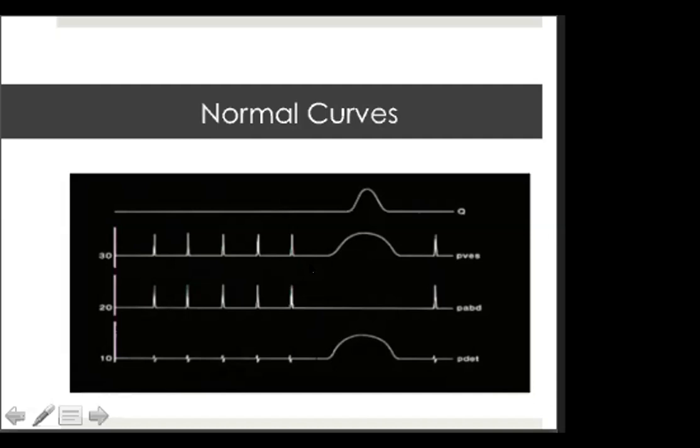Is this filling or voiding? This is voiding, right, sir? From filling and voiding, sir. This is the voiding area here, sir. The one on top, sir, this is the flow. What is the significance of the spikes there?